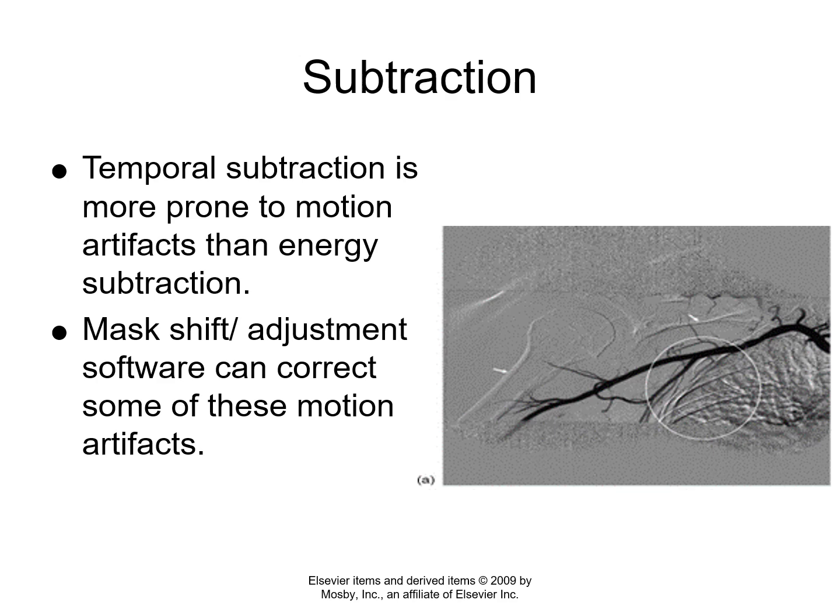and largely because motion is not true horizontal and true vertical. Motion is kind of in random oblique planes, or it could be a complex motion like an ellipsoidal motion, like you see in breathing. Okay, and so if the motion is just straight horizontal, straight vertical, yeah, you're going to clean it up real good with the mask shift software. But if it's not, and usually human body motions are not like pure linear motions in one direction or in two 90-degree vectors. It's a little bit more complex than that. It moves in random directions. That's the breakdown of the mask shift, okay?